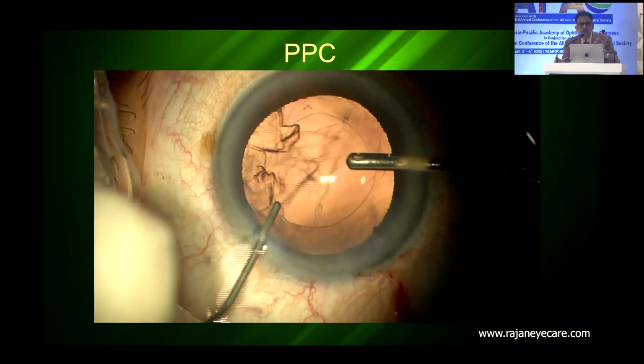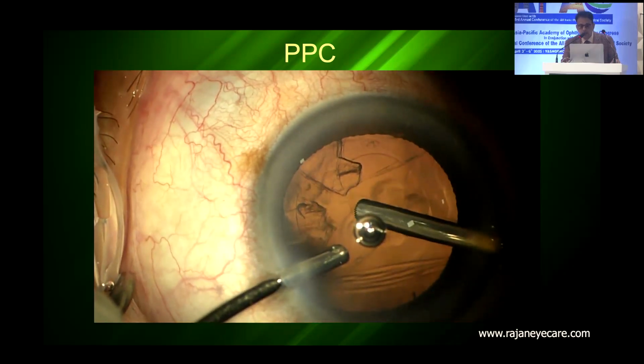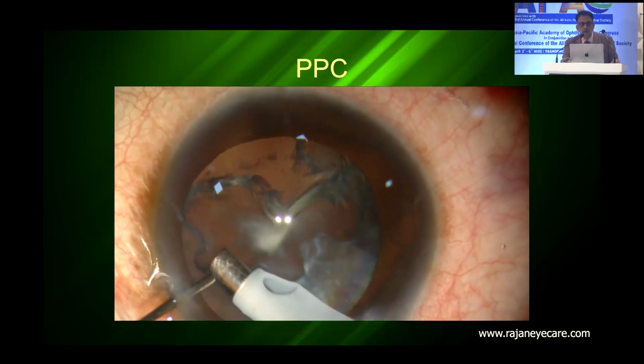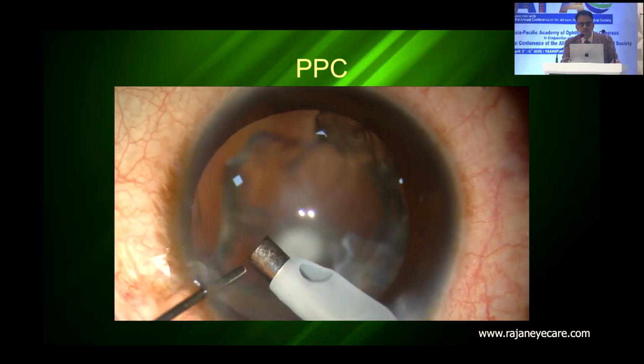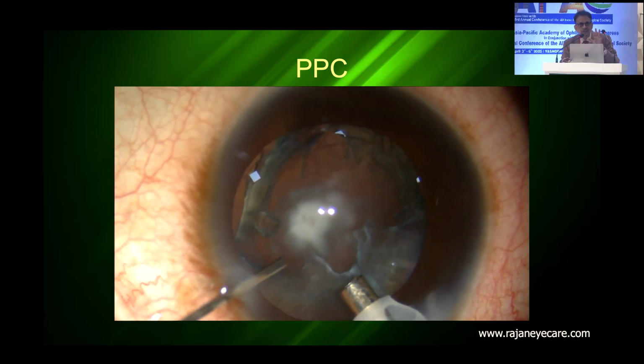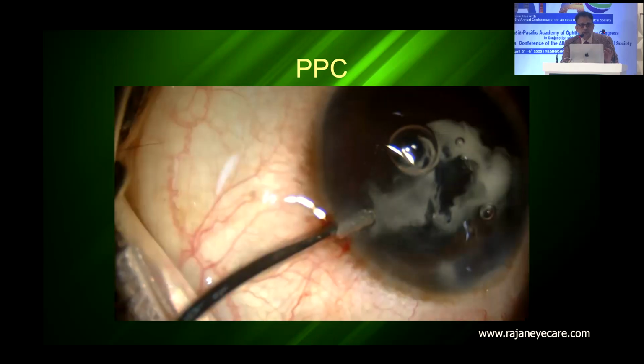Don't use sponges, don't use Dettol, don't pull the vitreous. You can go pars plana also, you can go limbal also, whatever you are using. And then go ahead and inject. You can see another patient with the posterior polar cataract, you can see the PC. Sudden deepening of the anterior and posterior chamber, and immediately inject Viscoat. Don't pull out of the eye, inject Viscoat.